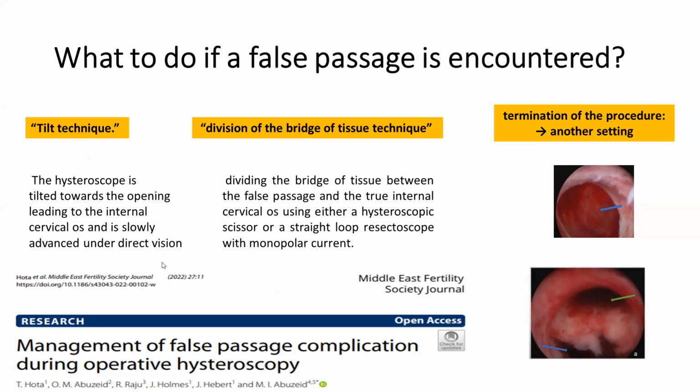And you can make dilatation if it is very stenotic, after you use the diagnostic hysteroscope to find its site and direction.